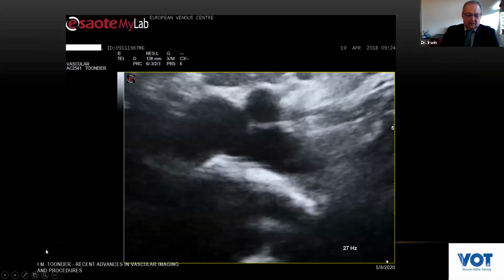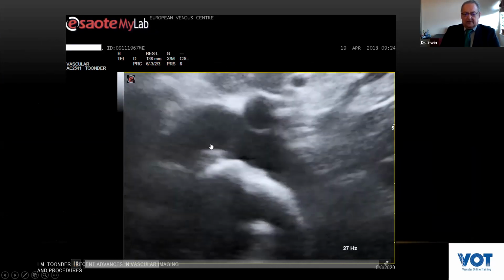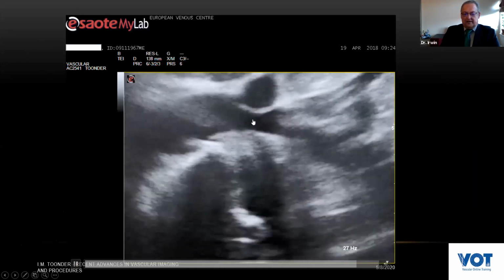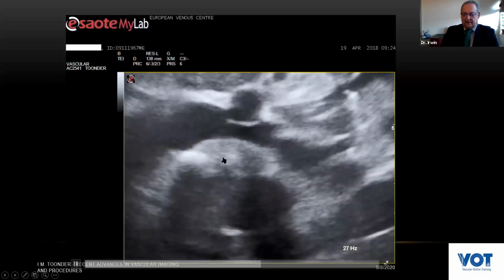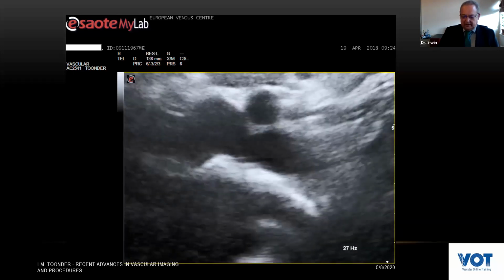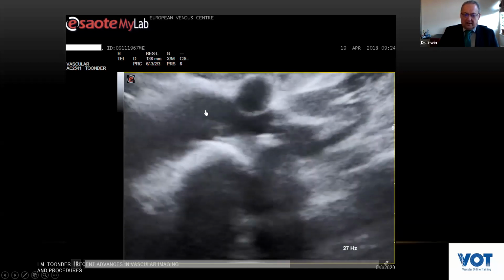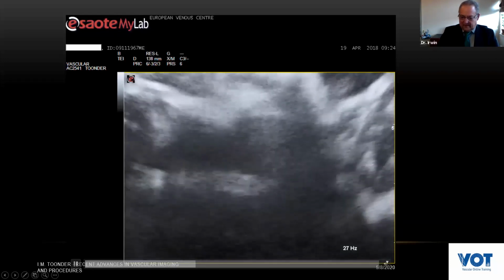This is a movie of the patient coming from an upright position going towards a supine position. I just want to see the effect and just watch what happens to the lumen. But the more interesting thing is here the echogenicity of the blood at this plane, at this part here in the vena cava. You can see it becoming echogenic, and this is the effect of compression. So you can actually see the blood becoming more compact due to the compression from going upright. And this is in a supine position. You would say, yes, this patient has a May-Turner. And then we have to say, is it a syndrome or anatomy, depending on what kind of complaints the patient is presenting. But this is the interesting thing, that you can actually see the blood becoming more echogenic, as it sort of looks as if, if you're looking at thrombus, you would probably believe, hey, it's becoming a thrombus at that very moment. It's not true.